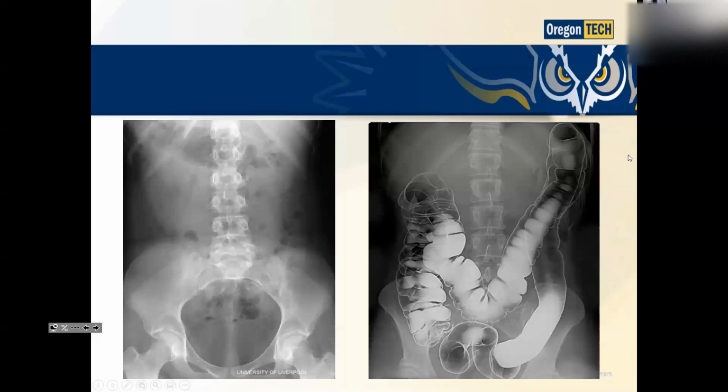Imagine being the patient going in. I don't know, maybe some of you have had to go in. It's a miserable procedure. Do you think the patient says, all right, I get to go in for a barium enema? No, they don't. They've been up most of the night with the prep because they're going to clean out everything. And so they're tired. Their rear ends hurt because they've been wiping, right? And then they are going to go to the hospital, and some stranger is going to put an enema tip in them and do this procedure. They're not real happy usually. So I used to tell them, you know what? You're going to feel like a puffed up toad, and then we're going to roll you around on the table.